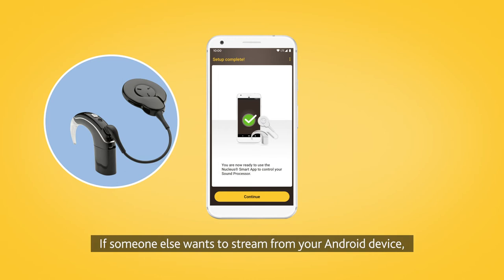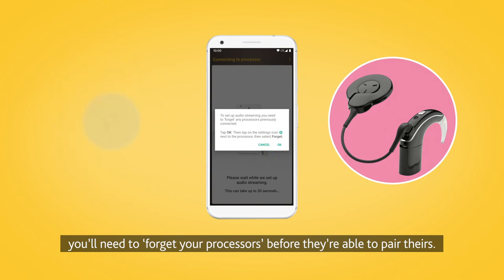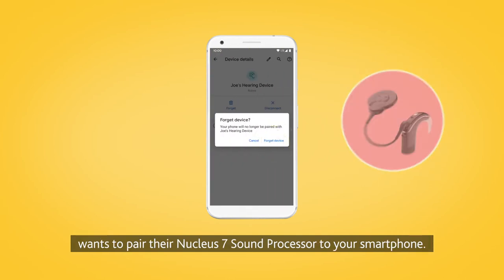If someone else wants to stream from your Android device, you'll need to forget your processors before they're able to pair theirs. You'll need to do this every time someone else wants to pair their Nucleus 7 sound processor to your smartphone.